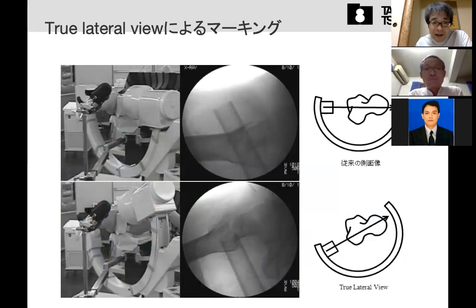So mathematically, between the horizontal and the vertical, we can find this view. In this view, the axis of the femoral shaft comes to the center of the femoral head. So we call it a true lateral view. So we always see the fluoroscope using the horizontal view like this, and the true lateral view like this, so that the femoral shaft center and the femoral head center come in the same line.